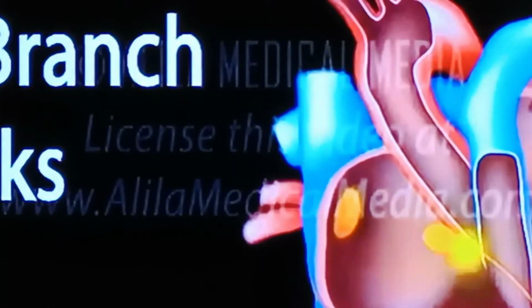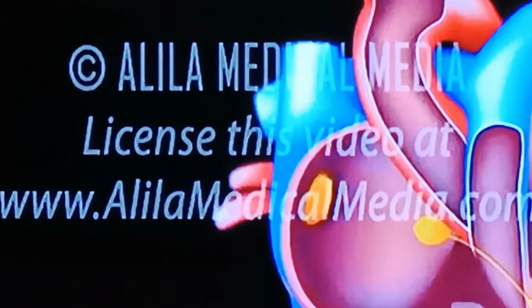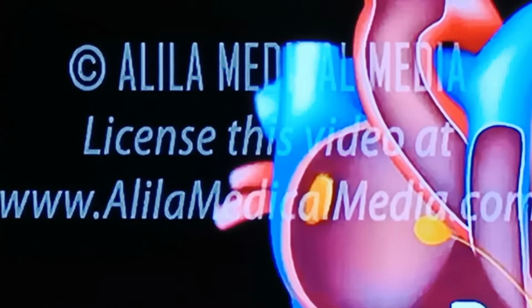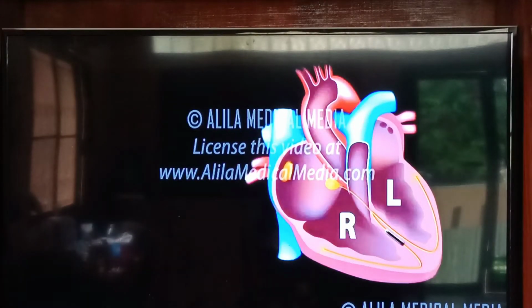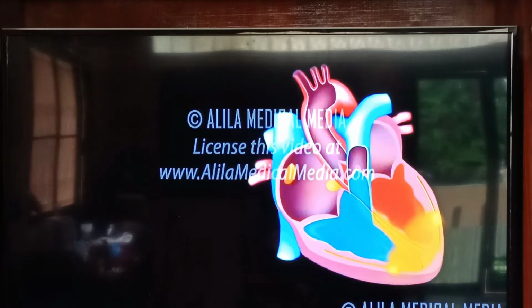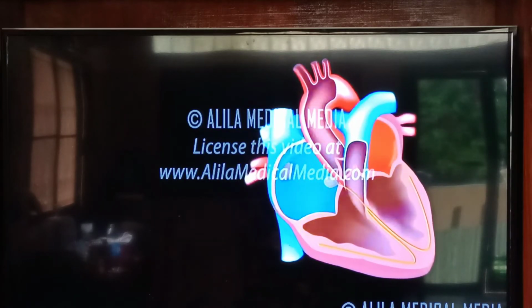Bundle branch blocks happen when there is an obstruction in one of the bundle branches. The names left bundle branch block and right bundle branch block indicate the side that is affected. In a normal heart, the two ventricles are depolarized simultaneously by the two bundles and contract at the same time.